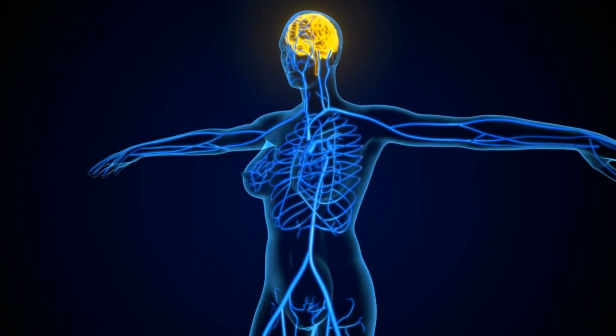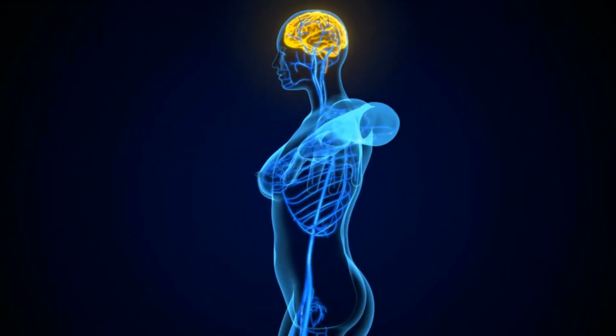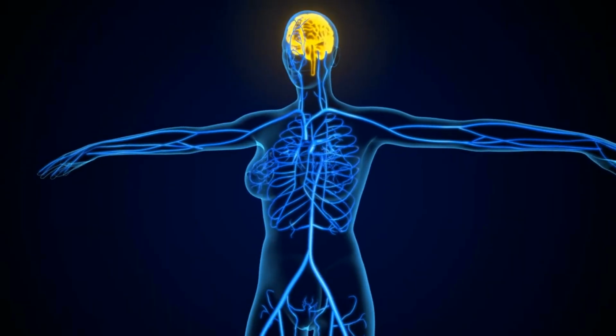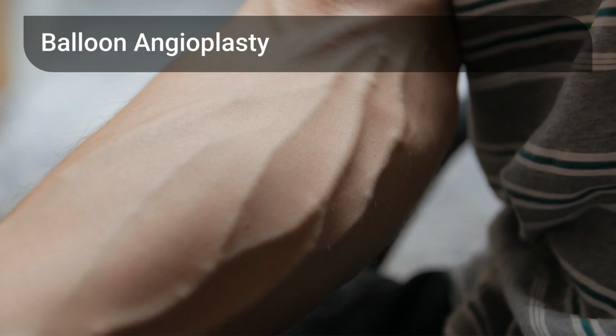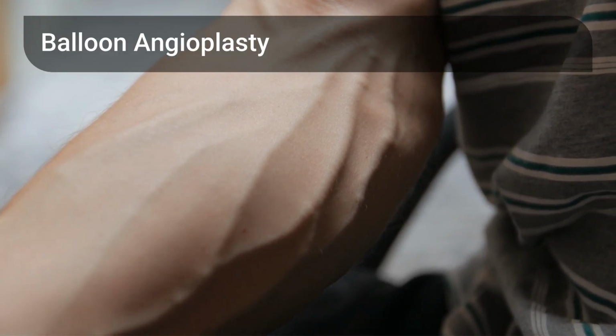Using X-ray guidance, the catheter and guiding wire are meticulously navigated through the arterial system until they reach the site of the blocked artery. The next critical step is balloon angioplasty, which opens up the narrowed artery.